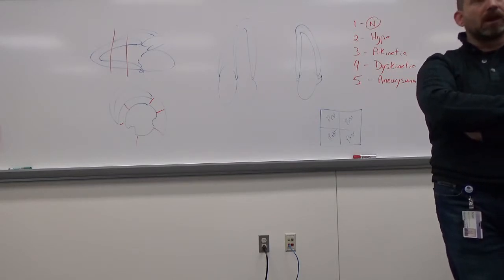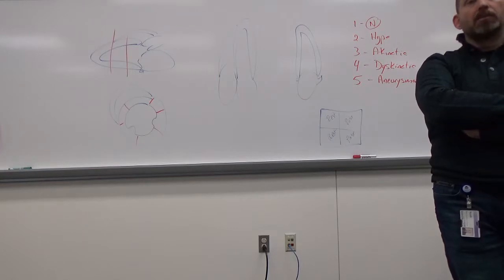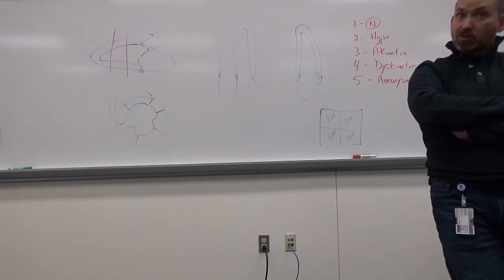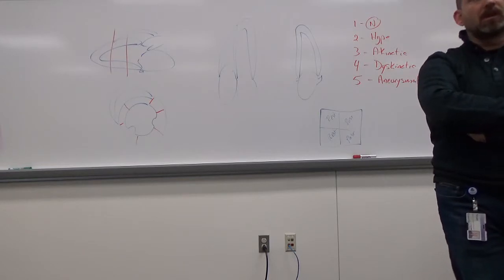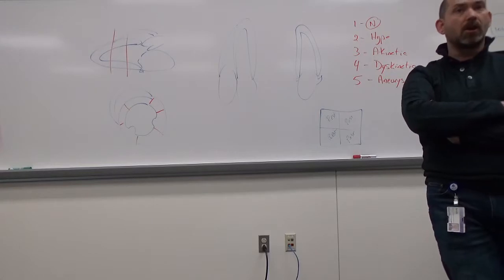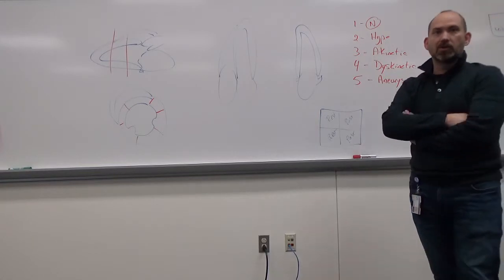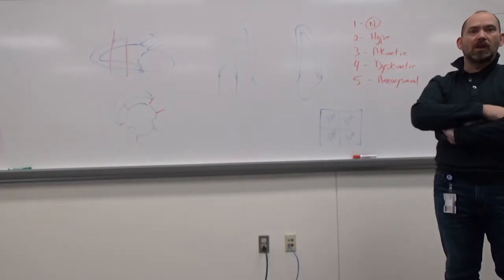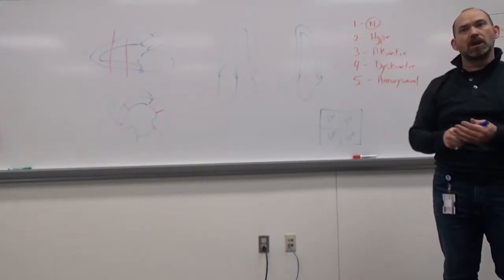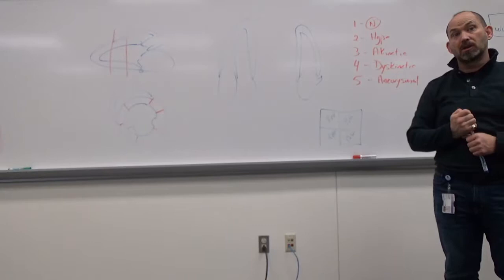Now, if it's a defibrillator, that could potentially be problematic, but I guess it would depend on the rate. And typically, if somebody is in a stress test and they have a pacemaker, it's under the control of a cardiologist, and they will make those decisions if it's adequate or not. If it's extreme heart rates, it's going to kick in.